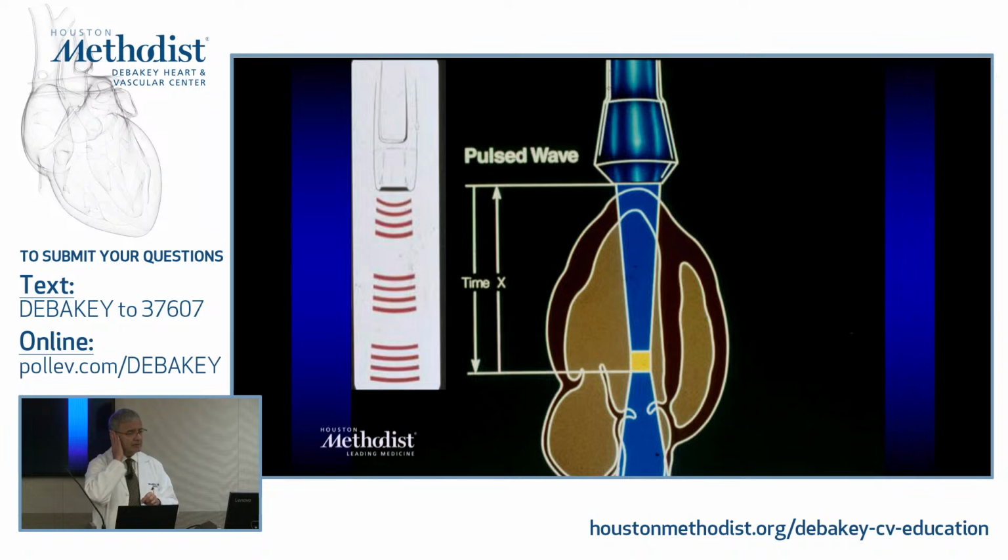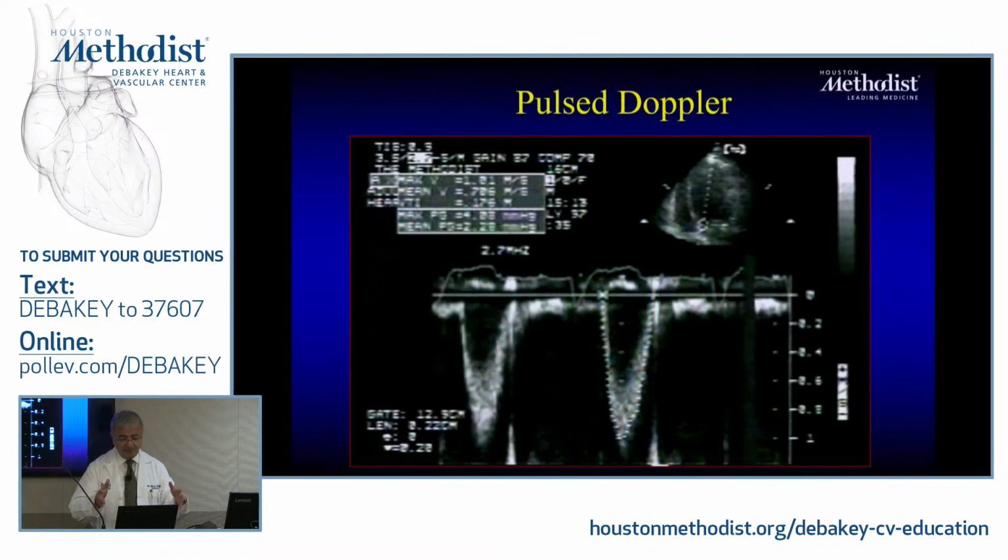So as a transducer, I keep my ear closed all the time till the distance or the time that it took from the burst of ultrasound to send it to come back, I open my ear and ask a question. How much was the frequency shift? You understand that? So I'm looking for a frequency shift. And let's say I have 1 meter per second or whatever it is. I know what the velocities are doing.